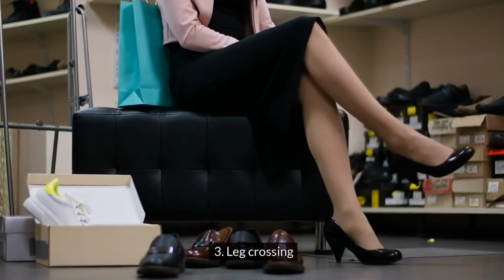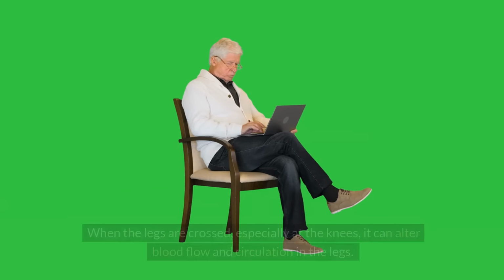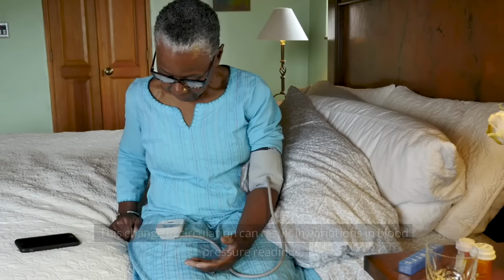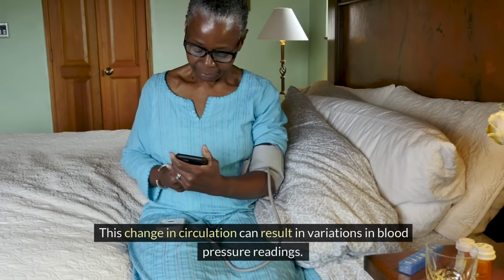3. Leg crossing. Crossing the legs while taking blood pressure measurements is incorrect because it can lead to inaccurate readings and affect the reliability of the assessment. When the legs are crossed, especially at the knees, it can alter blood flow and circulation in the legs. This change in circulation can result in variations in blood pressure readings.